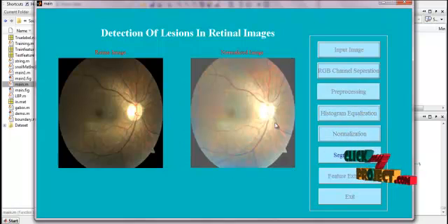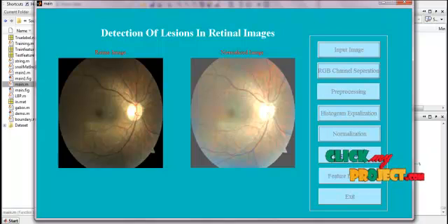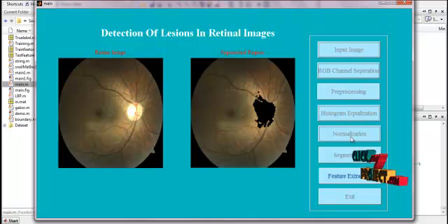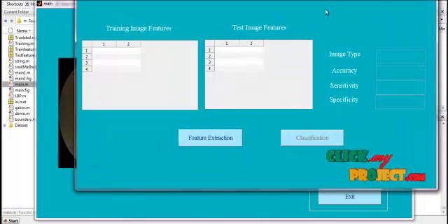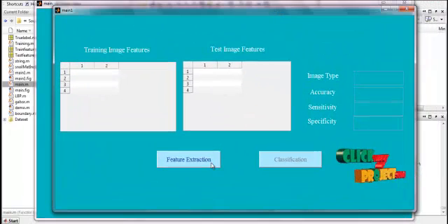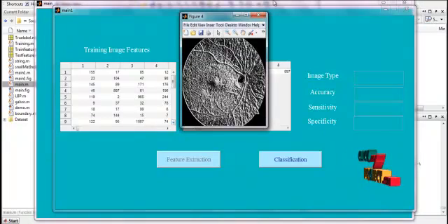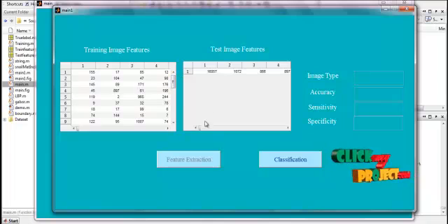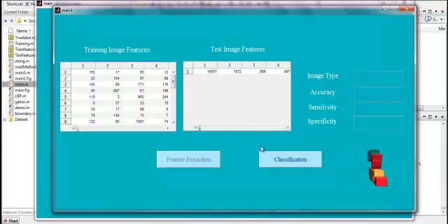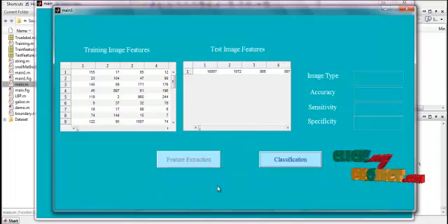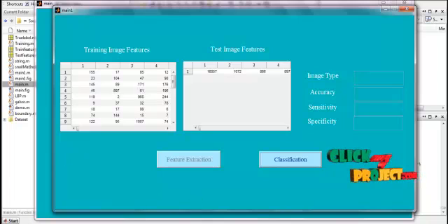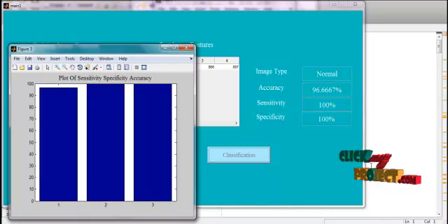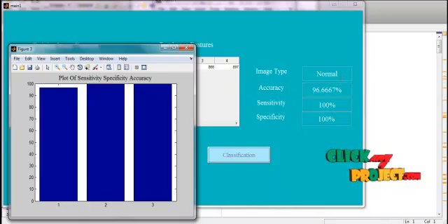Then normalization is applied to the input images. Then we are segmenting the input image — here the OD region alone is segmented. Then we are extracting the features from the image using LBP feature extraction. The training features were extracted and the test image features are shown. Then classification is performed using the probabilistic neural network, and the PNN classifies the input image as a normal image.